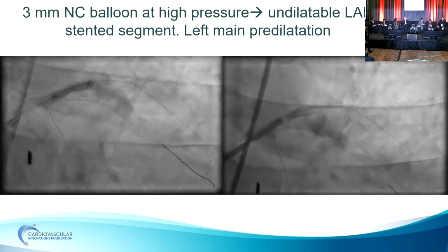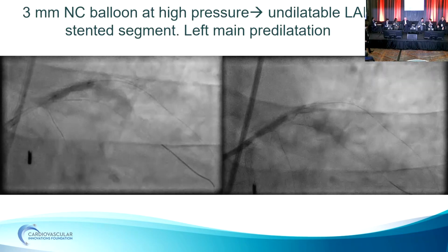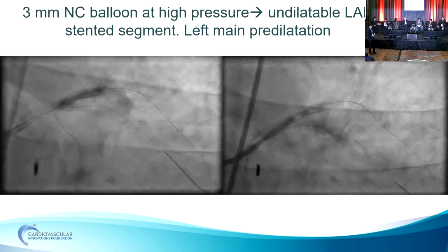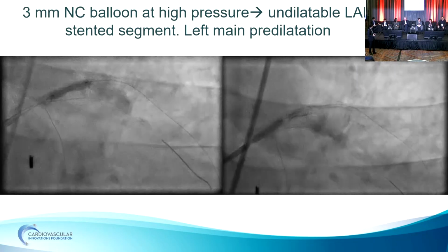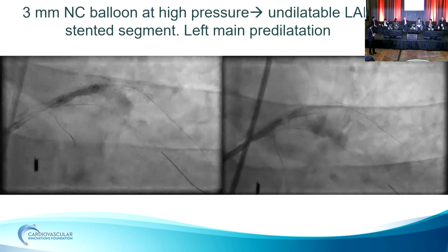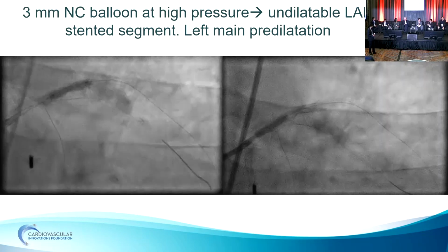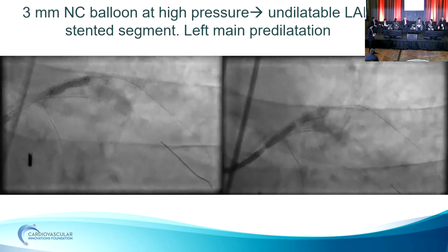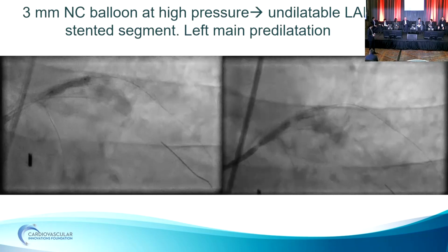Yeah, the problem lesion though is in the left main. We'll talk about that in a second. But for these single stent underexpansions, honestly, I think anything can work. Potentially IVL, laser with contrast, OPN. If you need to burr it out, all of those. The thing you must never do is put that second stent in, because that's when Brilakis gets these referrals with 4 stents in there. They're the ones that are not going to expand. So the single stent, you should be able to get it open with one of the new techniques that we have.